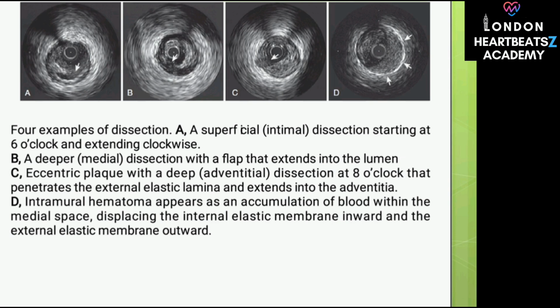Now let's shift our focus to how IVUS is utilized during interventional procedures, such as when a cardiologist is actively performing a treatment like angioplasty or stenting to address a blockage. The review lists quite a number of applications in this setting. Indeed. IVUS plays a really vital role in many different aspects of interventional cardiology. It's particularly helpful in situations where there's angiographic lesion ambiguity.